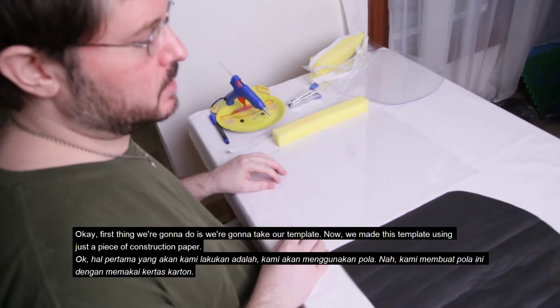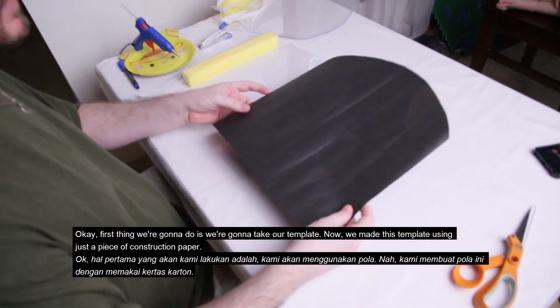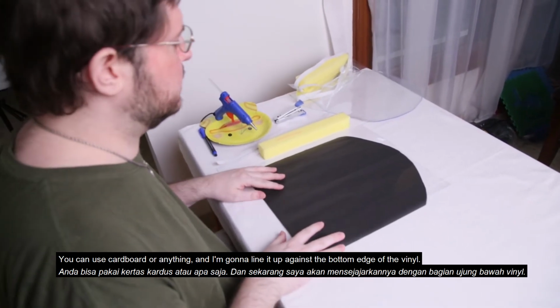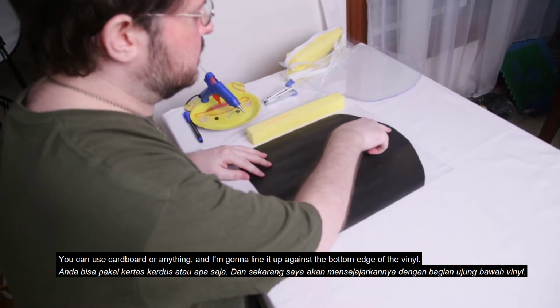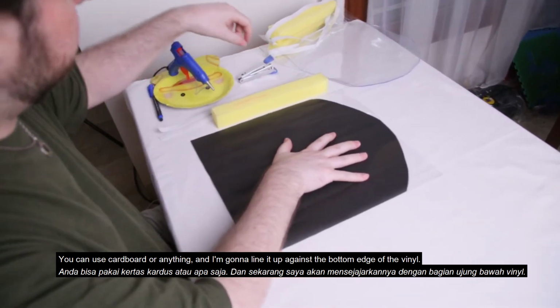Okay, first thing we're going to do is take our template. Now, we made this template using just a piece of construction paper. You can use cardboard, anything. And I'm going to line it up against the bottom edge of the vinyl.